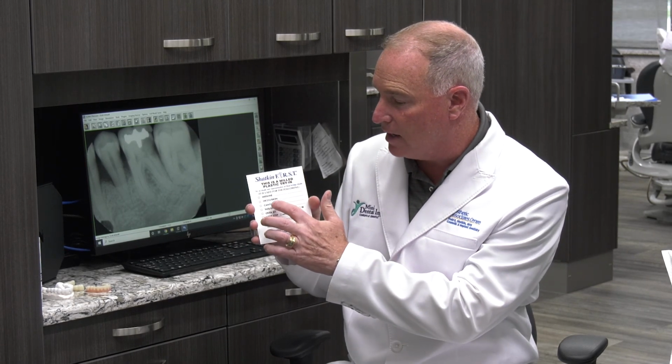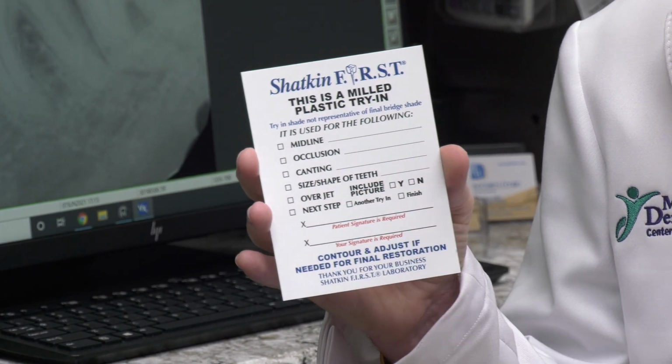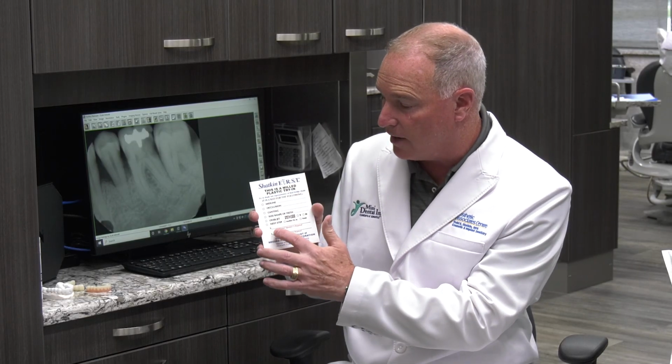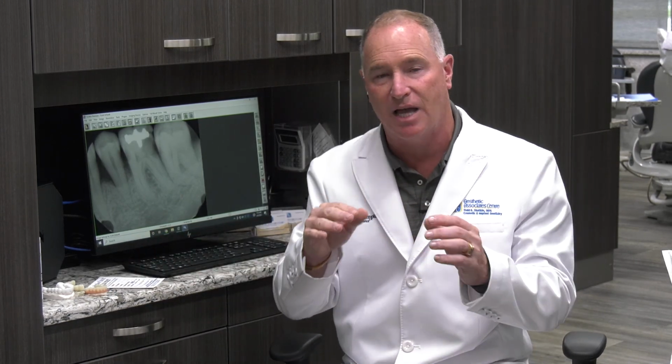You get this little card with the try-in, and this is a milled plastic try-in. You're going to check the midline, the occlusion, canting, size and shape of teeth, overjet, and the next steps, okay? So make sure you mark those off, and if you're making some changes, make a note of what you changed, and all you need to do is go ahead and do the changes on that try-in.